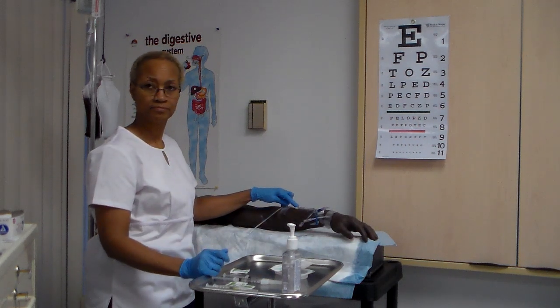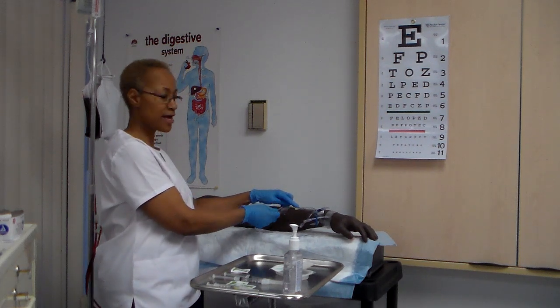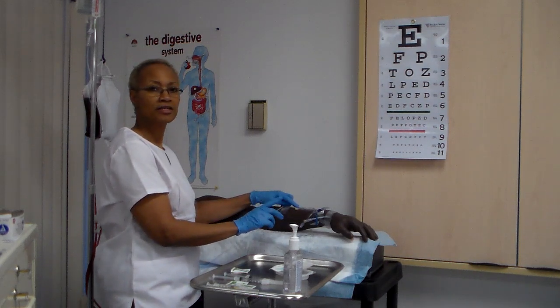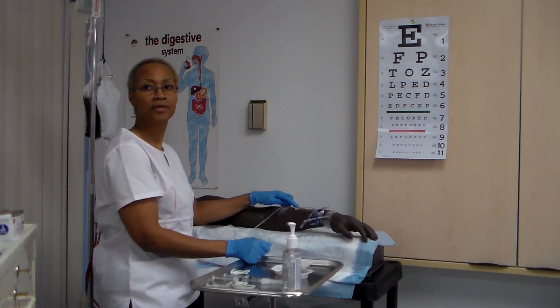Pull back gently on syringe's plunger to aspirate blood return. All right, so you're going to always aspirate back. Look for a blood return that identifies that, yes, that catheter, that angiocath that's in place is in the vein. Okay, you'll see a blood return. All right.